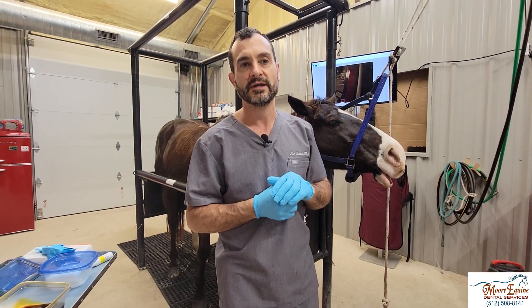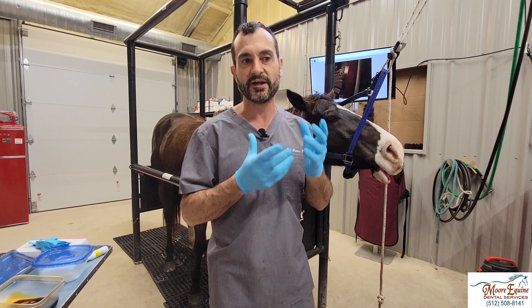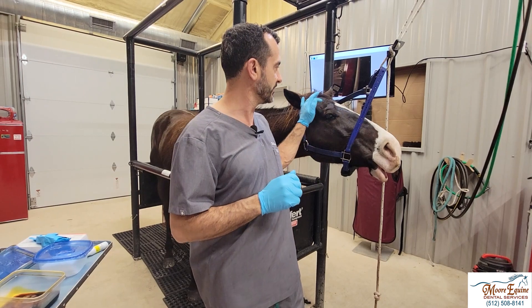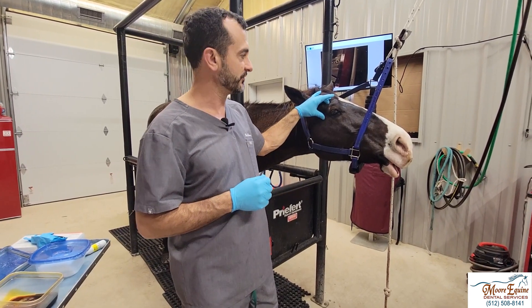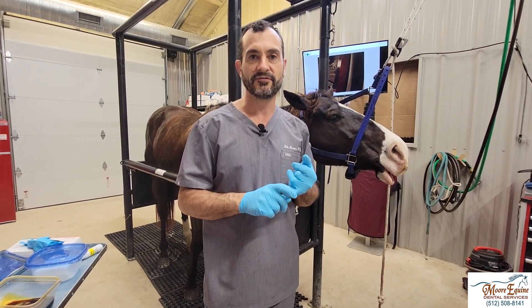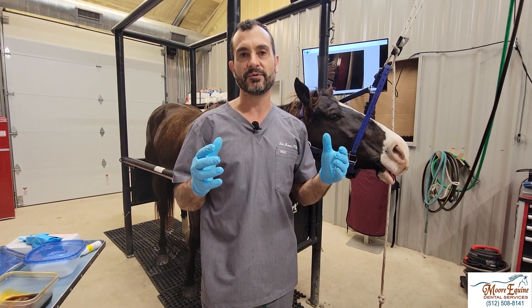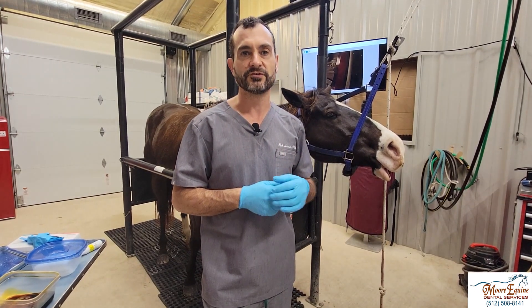I use a new bottle of anesthetic every time — I prefer lidocaine — and I use sterile gloves and do a full prep just as if injecting into a joint. During the scrub it's important to have the horse's head up high; if the head is too low it causes blood vessels to distend, making a retrobulbar hematoma more likely. Hematomas don't personally concern me — every now and then I get a flashback of blood, I raise the head and hold pressure. If swelling occurs it looks bad for a day or two but typically regresses fast, especially if you hold pressure after a flashback. What matters most to me is that the block is effective and effective rapidly, because faster procedures mean less anesthetic and fewer complications.